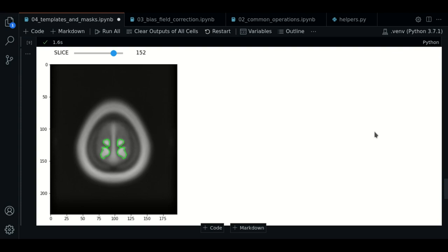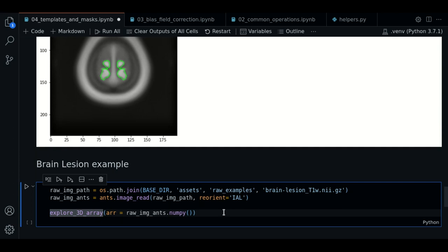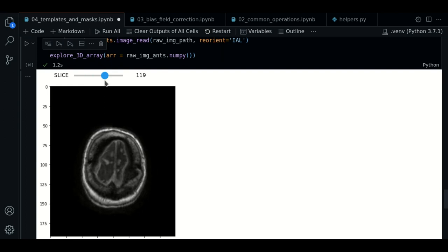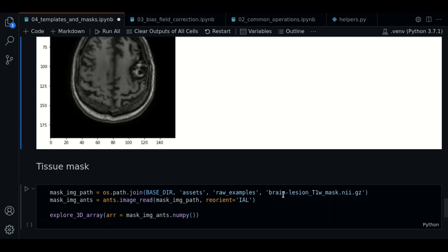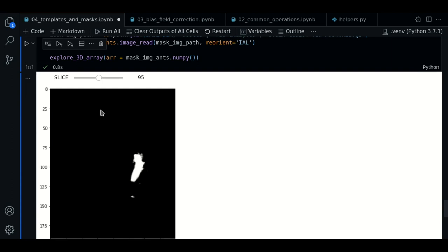So now let's review the same process, but for a tissue mask. We have an example of a brain lesion image. We load it with antspy as usual. Then we load the tissue mask. We follow the same convention as before, and we plot it.